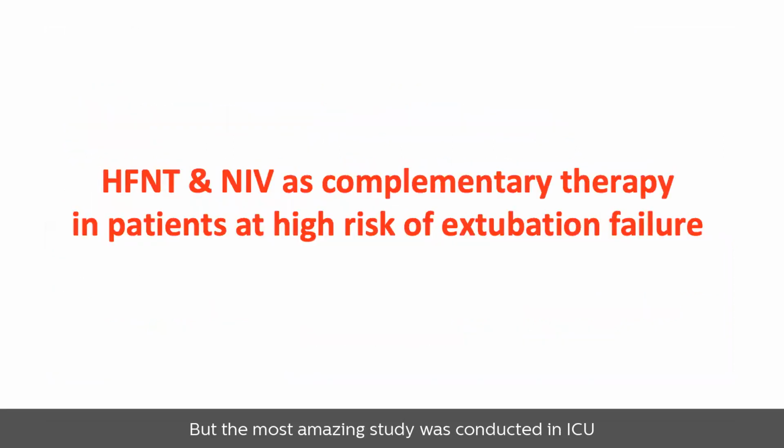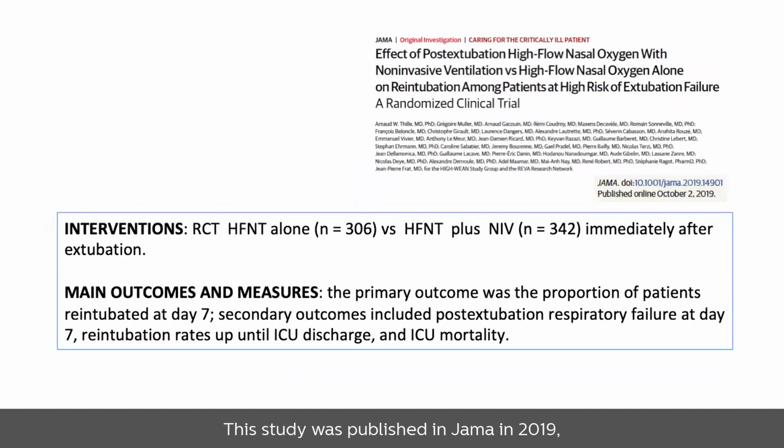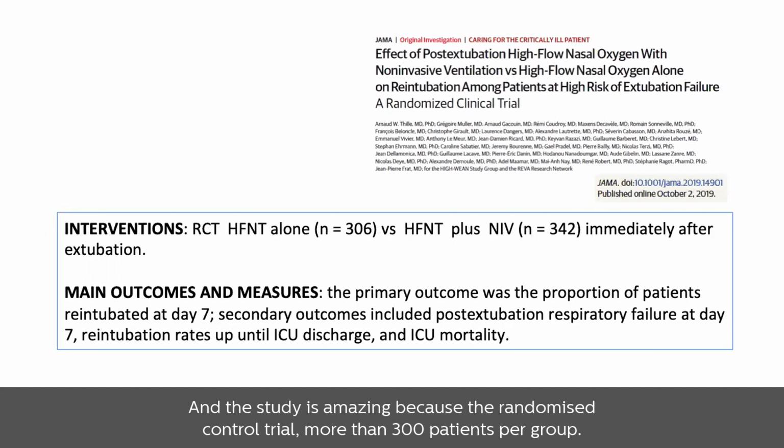But the most amazing study was conducted in the ICU on the combination of high flow and NIV as a complementary therapy in patients at high risk of extubation failure. This study was published in JAMA in 2019 by the group of Arnaud Thille with Alexandre Demoule, and the study is amazing. It was a randomized controlled trial with more than 300 patients per group.